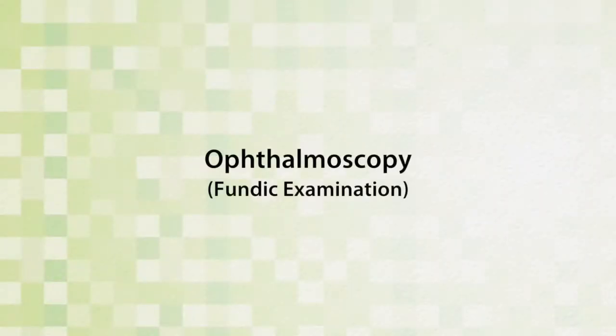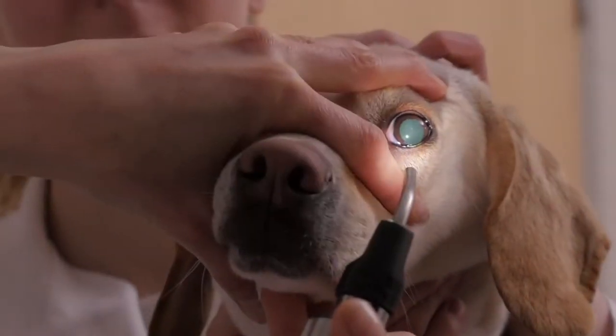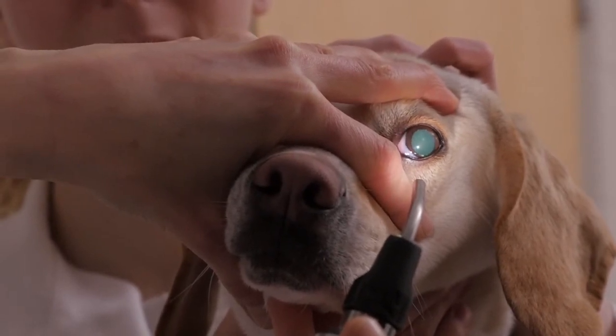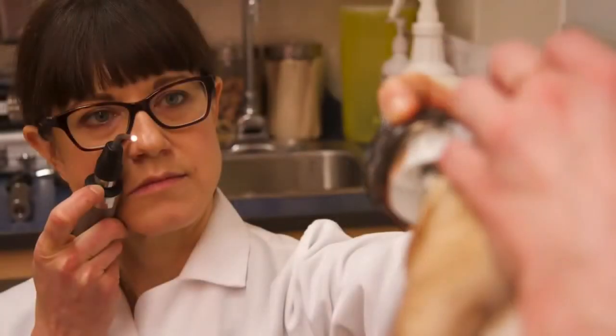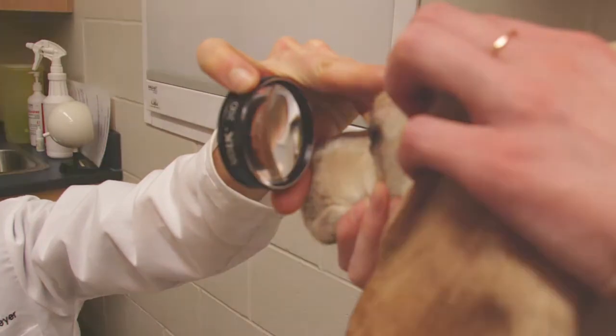Ophthalmoscopy. Ophthalmoscopy is also known as fundic examination. It is used to examine the vitreous, optic nerve, retina, and choroid, and is the final step of the general ophthalmic examination. Ophthalmoscopy is performed in a darkened room through a dilated pupil. It is important to make sure the light source being used is not brighter than necessary when performing ophthalmoscopy. Too high of a light intensity may contribute to an uncooperative patient.